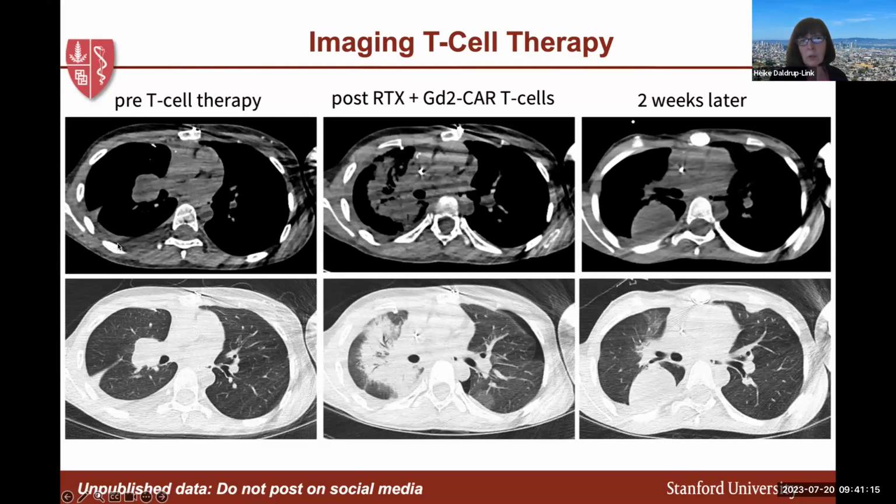And so it was decided to apply palliative radiation therapy to this lesion here at the right hilum. There were more tumor nodules here along the pleura, and it is usually impossible to irradiate the many sites of a patient, because osteosarcomas are relatively radiation insensitive, and so we need quite high doses in order to achieve a response. So this part was irradiated, and then the patient received CAR T cells. And initially we saw a marked infiltration around this lesion at the right hilum, and more so than we would usually expect based on radiation alone.